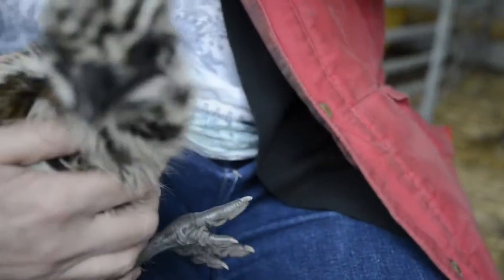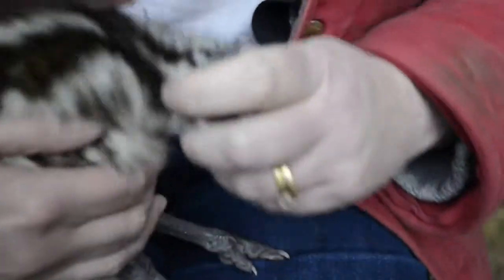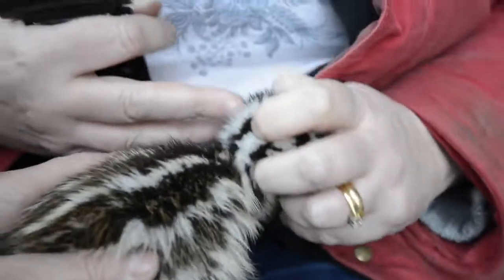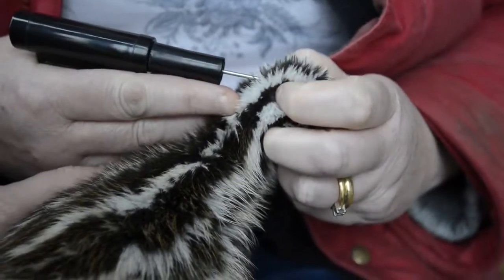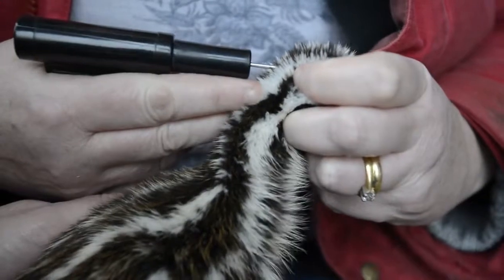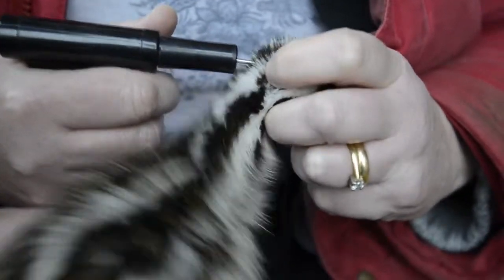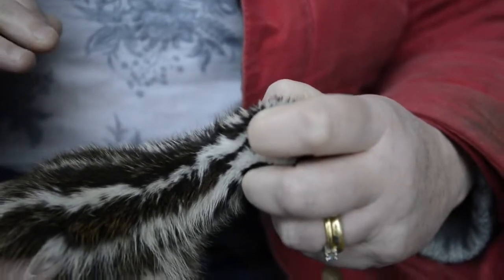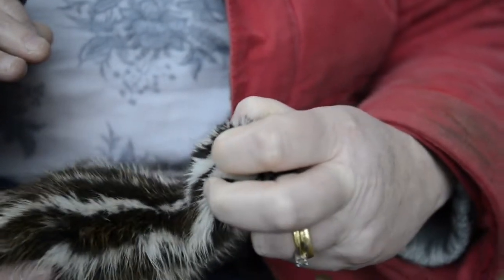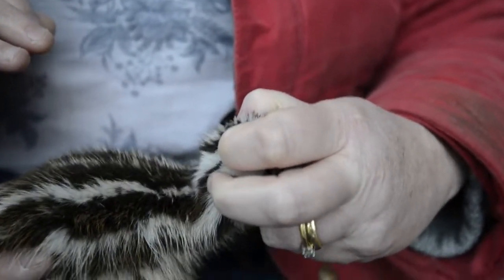So then what we do is take the lid off, make sure we're in the right area, isolate the muscle between the thumb and the forefinger, and then insert the chip. Press, and then just pinch afterwards to keep some pressure on there and stop the chip from backing out.